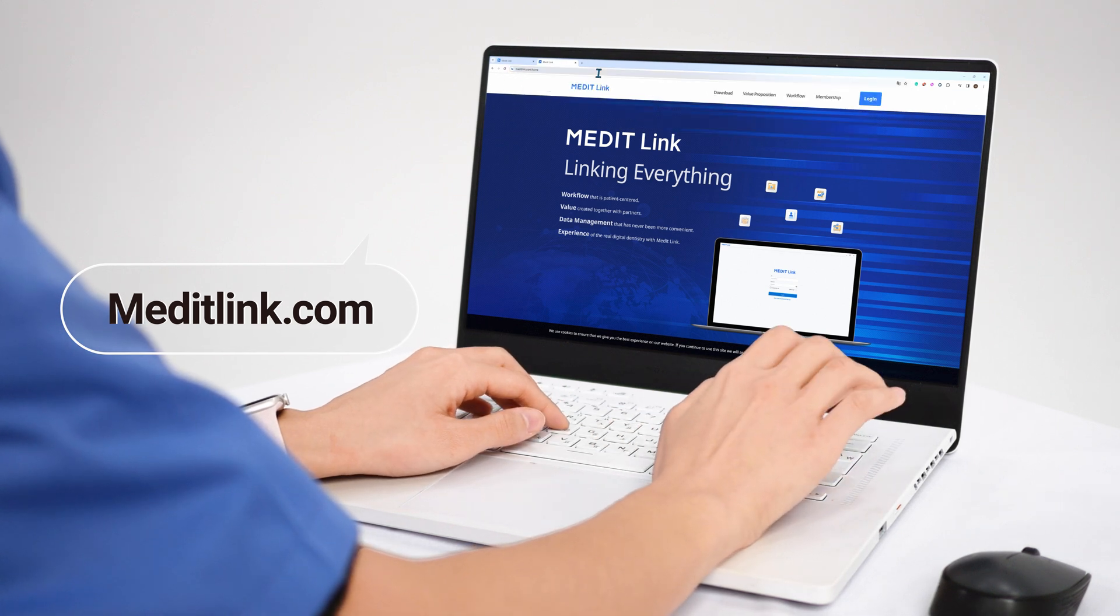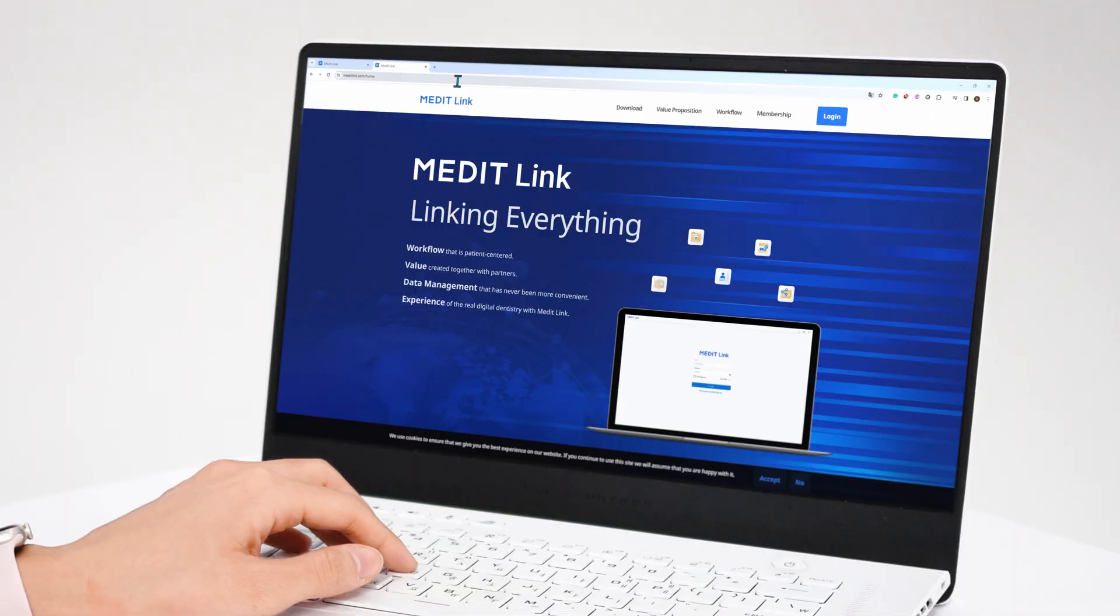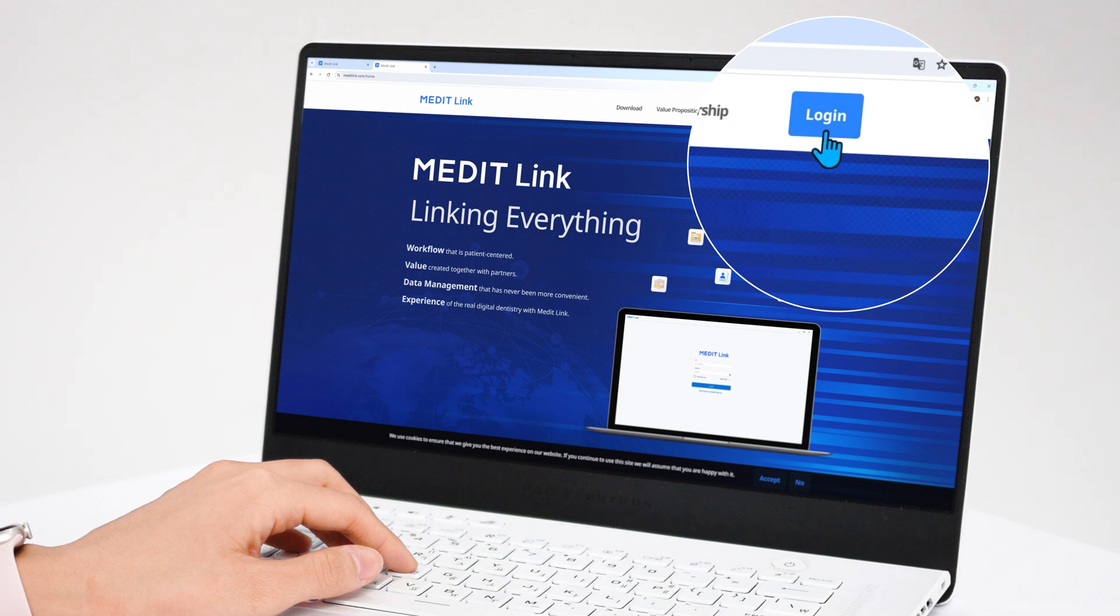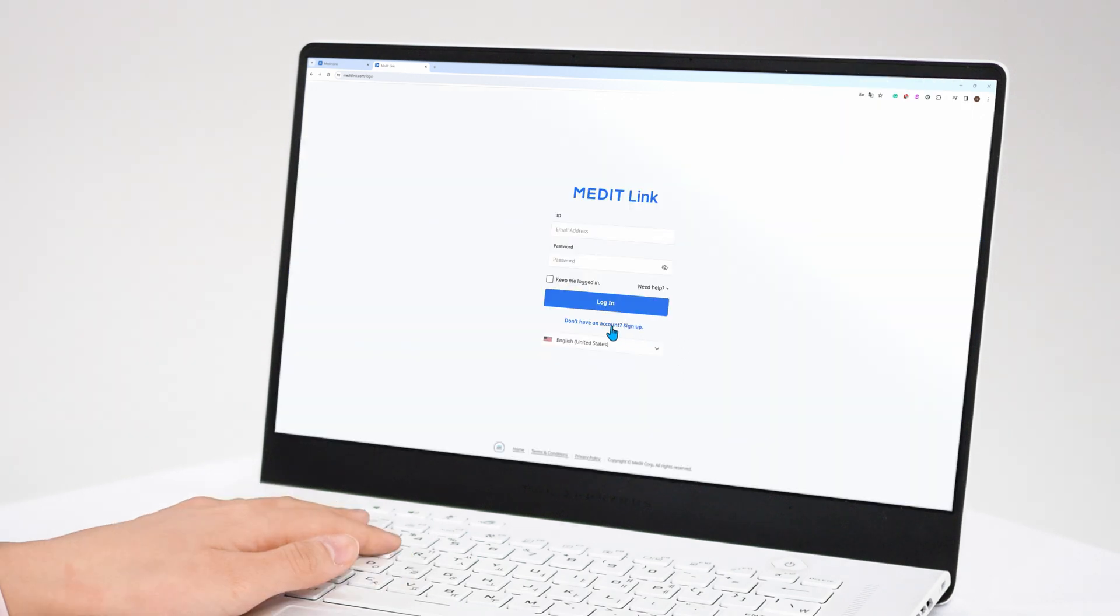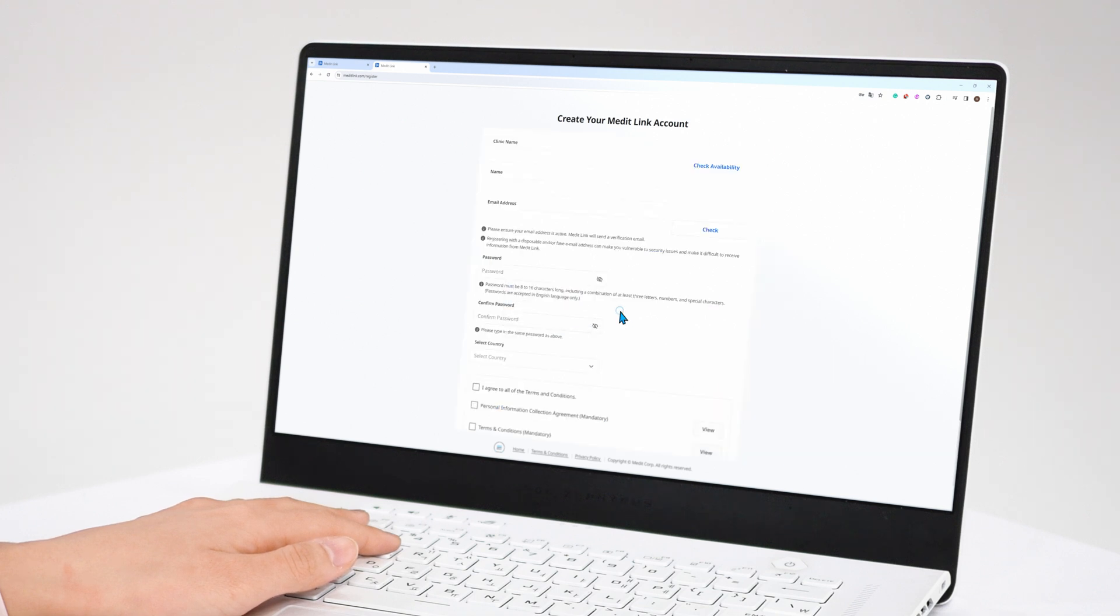On your computer, go to meditlink.com and on the login page click the sign up phrase. We have options for clinic accounts on the left and lab accounts on the right. We'll create an administrator account for a clinic.